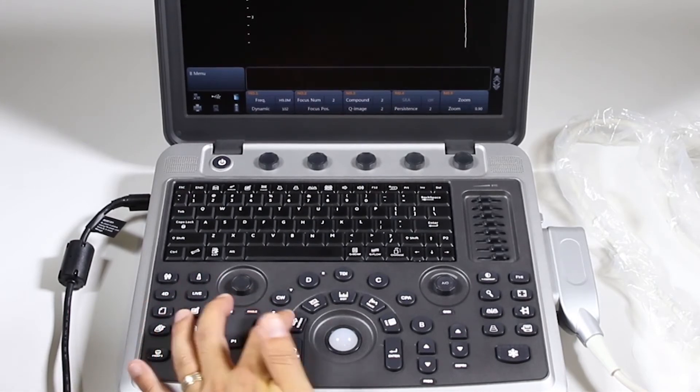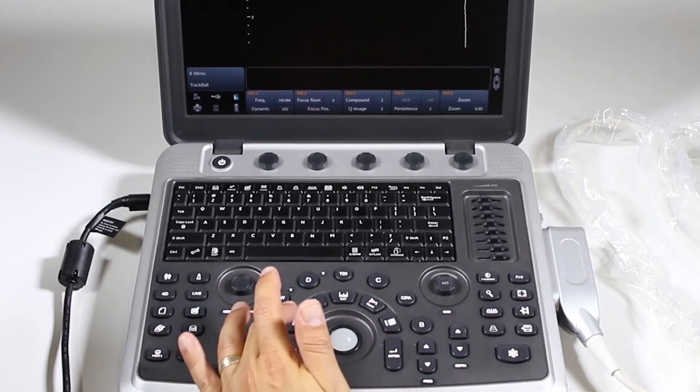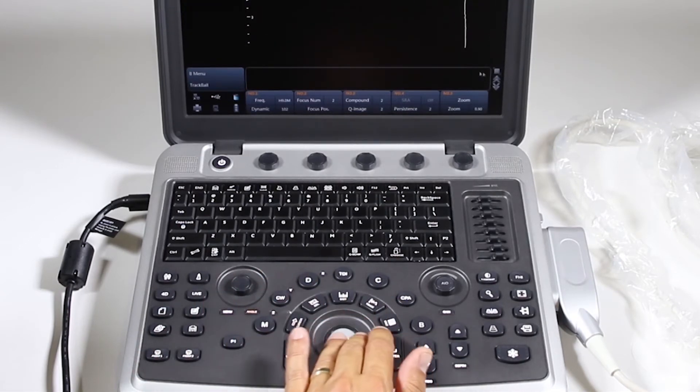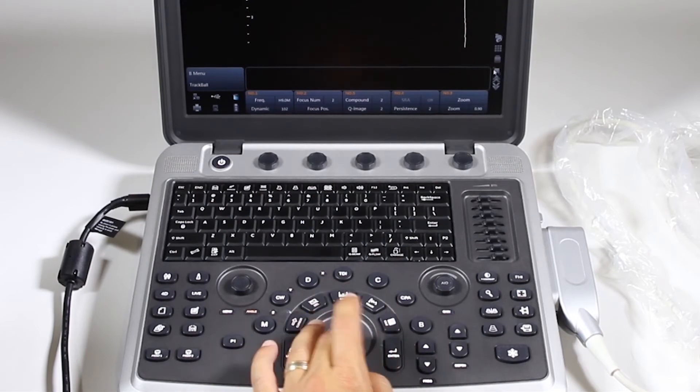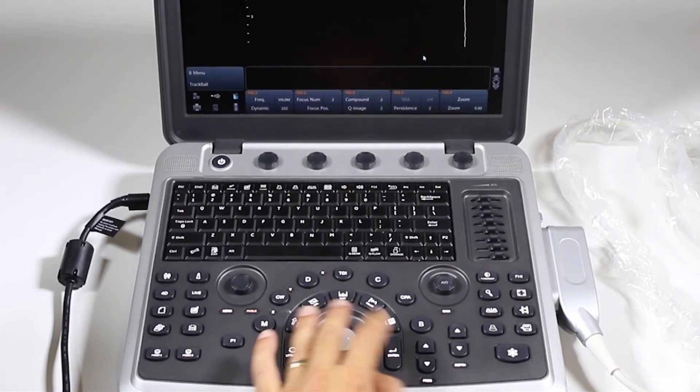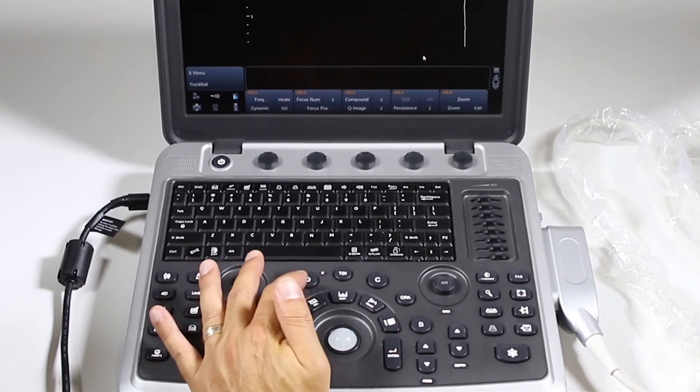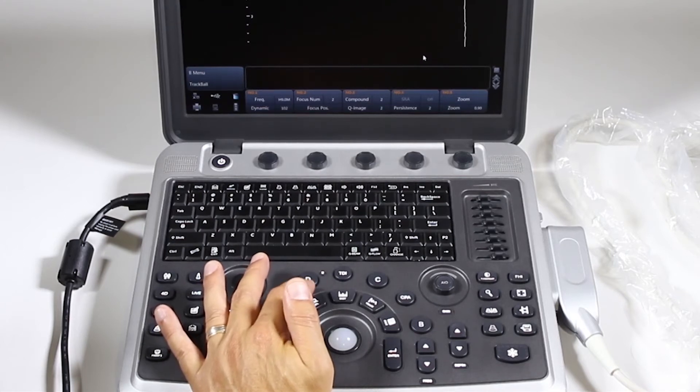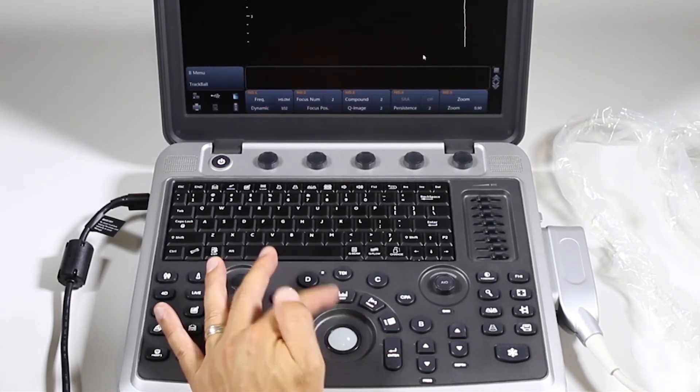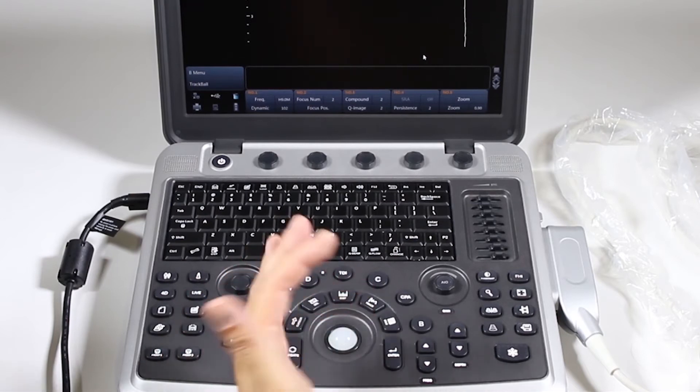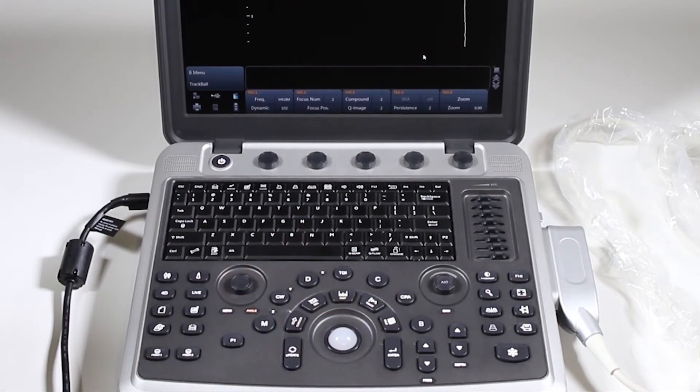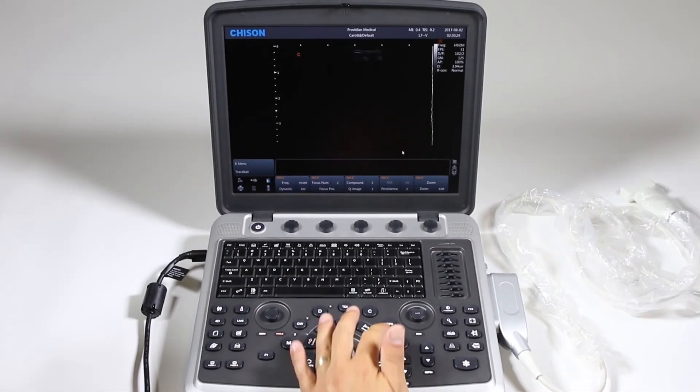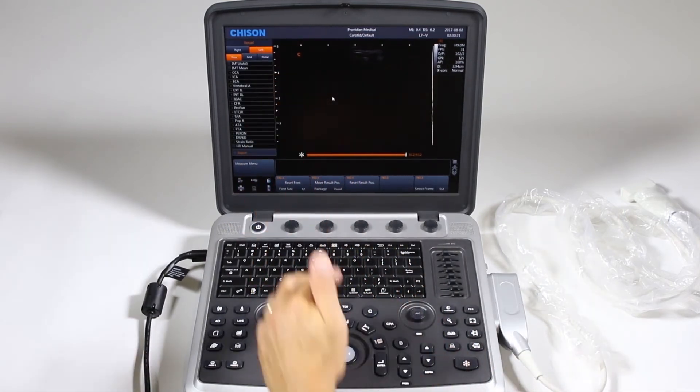Cursor, whenever you want to get the arrow on screen, just push it and go on, and you'll use that to select various things around the keyboard or images down there. Delete. This will delete comments or arrows or measurements on the screen. Distance for a simple distance measurement. Trace, simple trace.